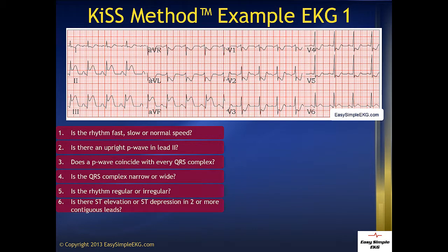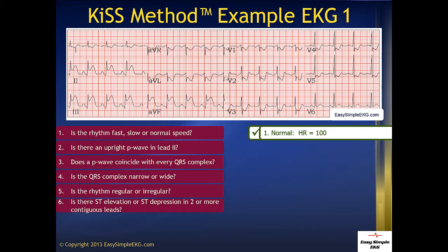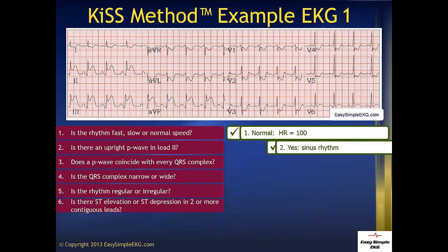Question 1: Is the rhythm fast, slow, or normal speed? It's normal with a heart rate of 100. Question 2: Is there an upright P wave in lead 2? And there is. This means our patient is in sinus rhythm, and that's normal.